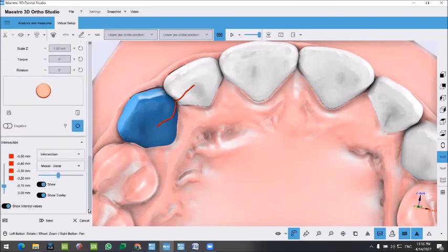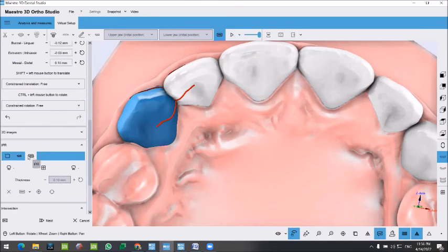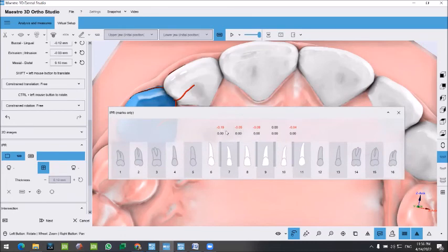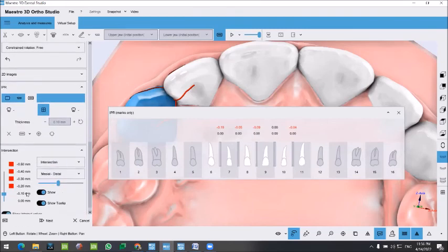I'm going to tell the software to generate a PDF with the IPR needed and where exactly. All I need to do is press on the IPR button, choose the sheet. The software will automatically detect the IPR needed. You see, I changed my values so that I'm not going to see anything less than 0.1. So the 0.05, 0.09, I'm not going to see that.